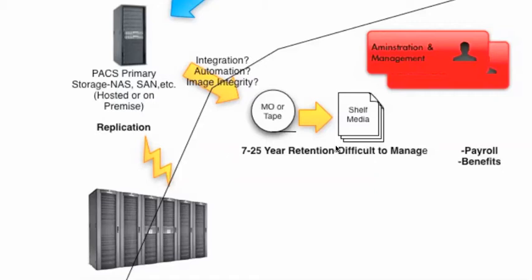Now, the VNA solution may provide additional functionality. Like, in our case, our solution provides a Tier 2 image cache on site, as well as disaster recovery and business continuance functionality. But we don't want to confuse the issue by saying a VNA has to provide the disaster recovery and business continuance, etc. I think a long-term storage solution has to provide this long-term data retention that provides always reliable, always available, always secure data storage for your diagnostic study information.